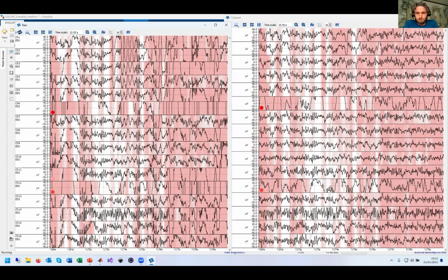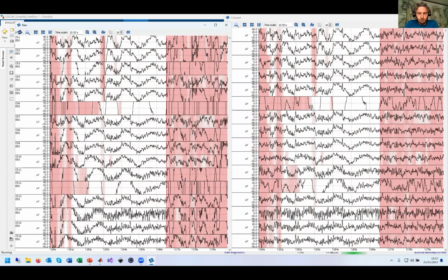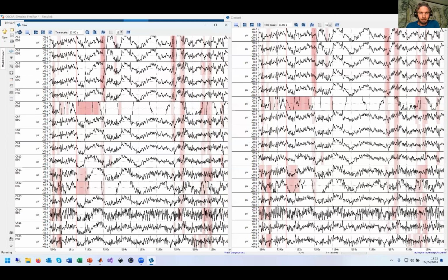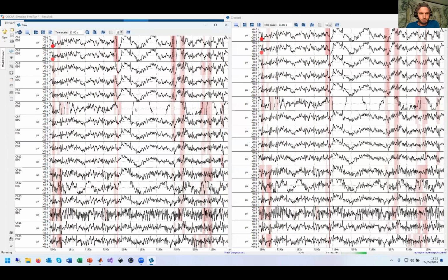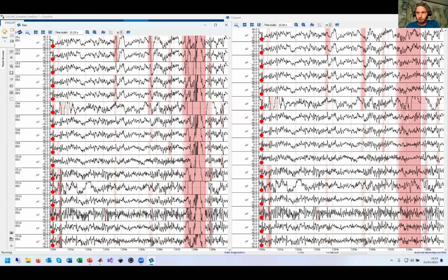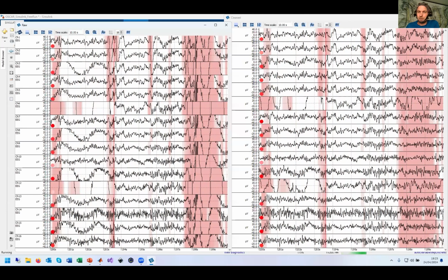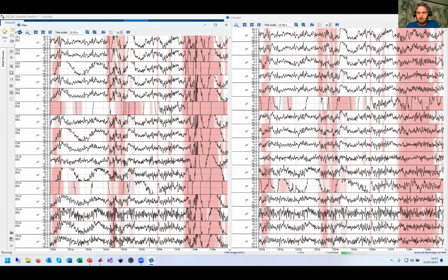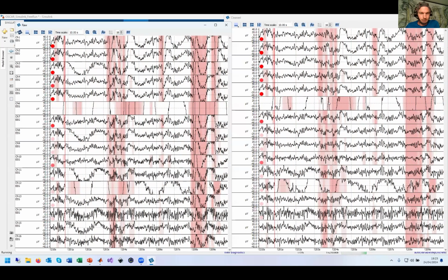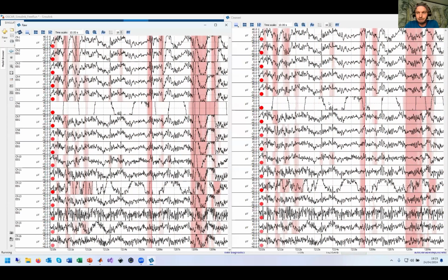Yeah, so we can simply say that the channels that are connected fairly well in general, they are corrected very well. As I said, channel 6 is a bit nasty. So sometimes the correction is not so good. It's basically because Oscar has adapted to the spatiotemporal characteristics of channel 6. So it allows it a bit more to fluctuate because it has been presenting itself as a channel with fairly large amplitudes and slow waves.